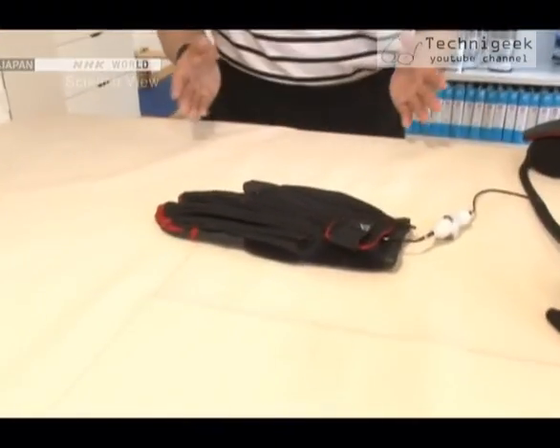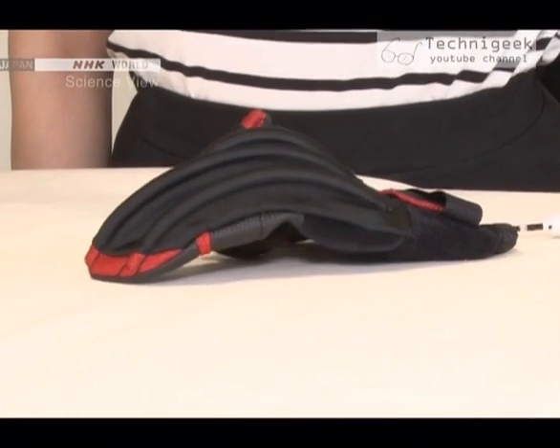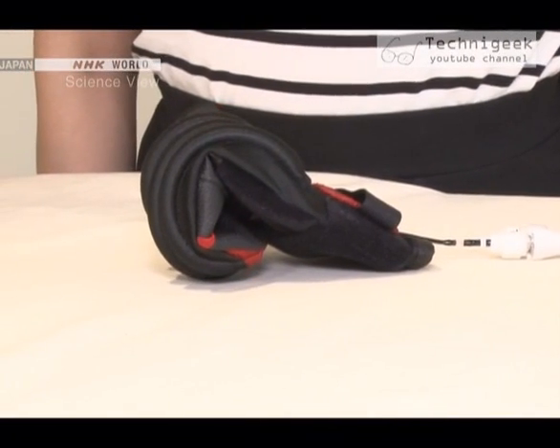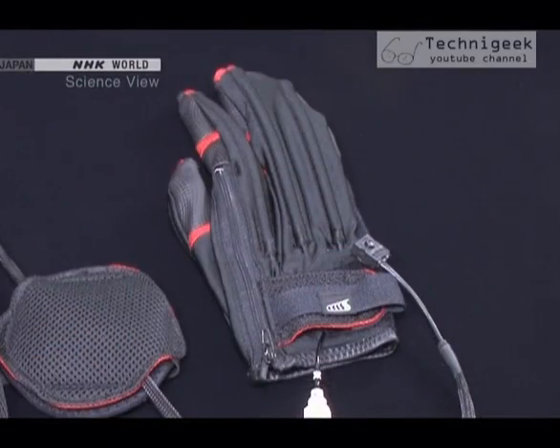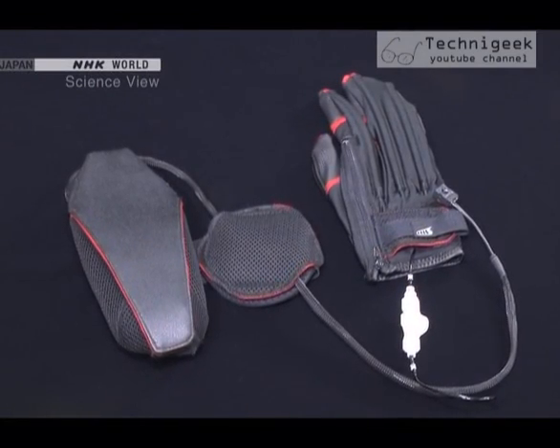What is the function of the glove that the Takumi developed? It's moving and clenching the fist! What a surprise! This is a glove that assists people who cannot clench their fist due to an illness or injuries.